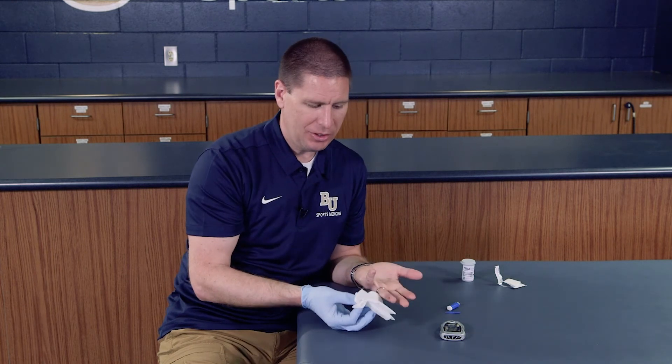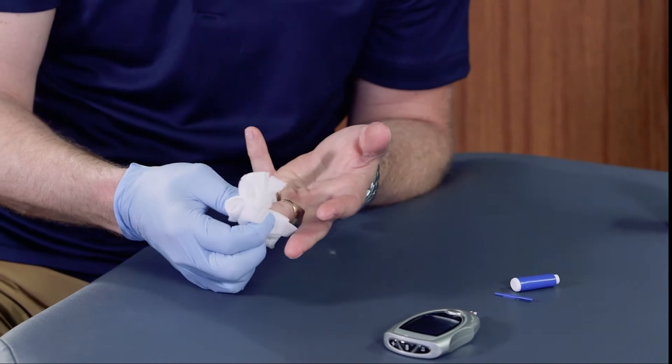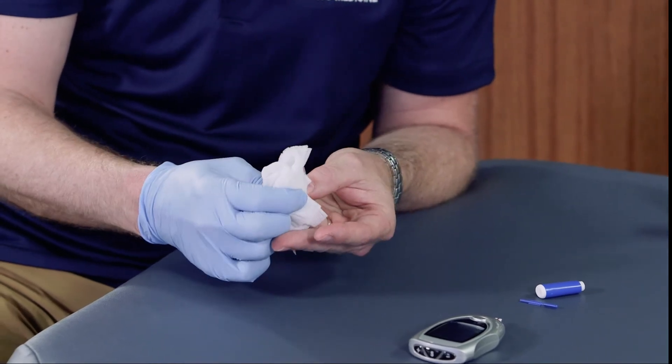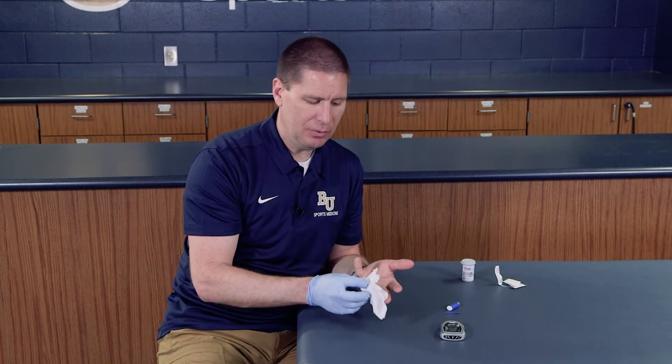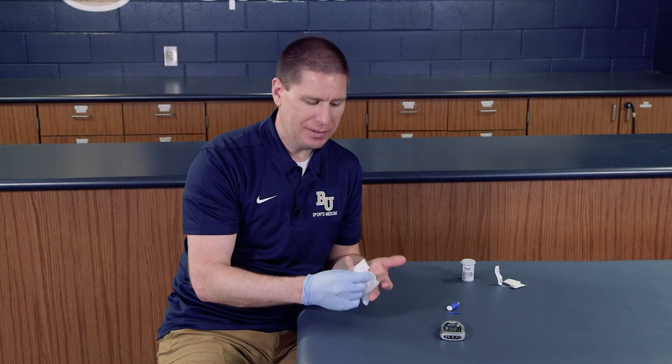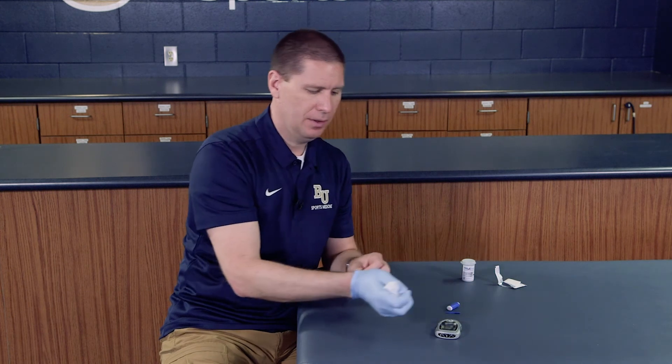Once you're done, you want to make sure that you handle this blood and biohazard material appropriately. I've got some gauze and I might place a band-aid on my finger. Make sure that you place the strip in a biohazard container along with any other biohazard waste. I can pull this off, take my gloves off, and dispose of that in a container.